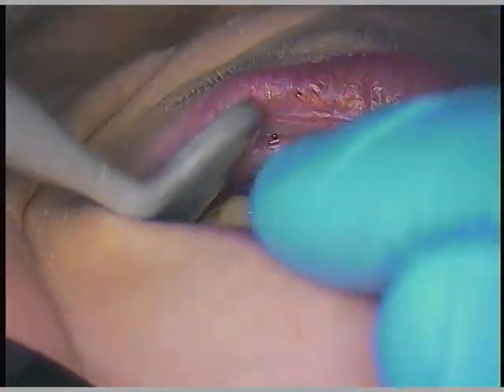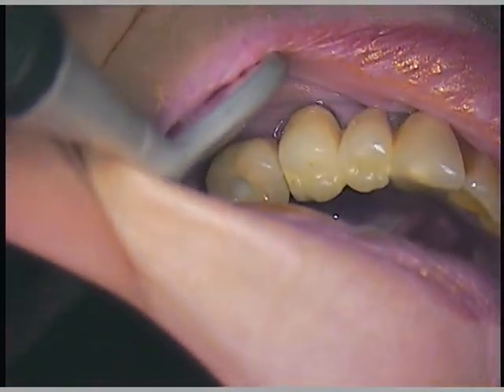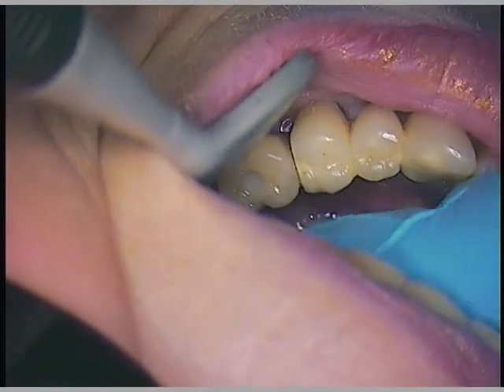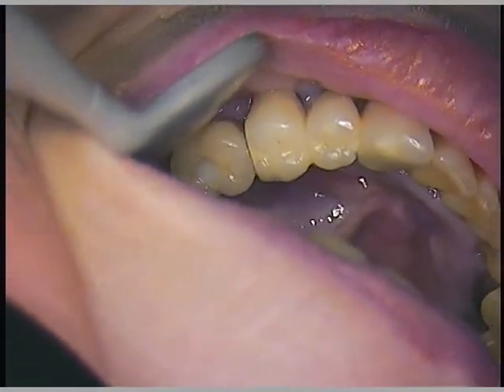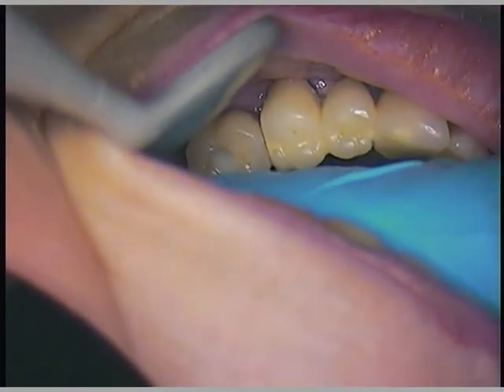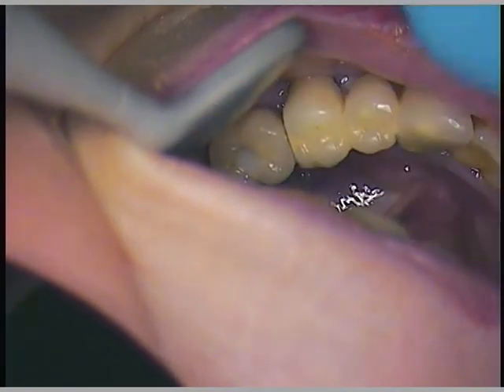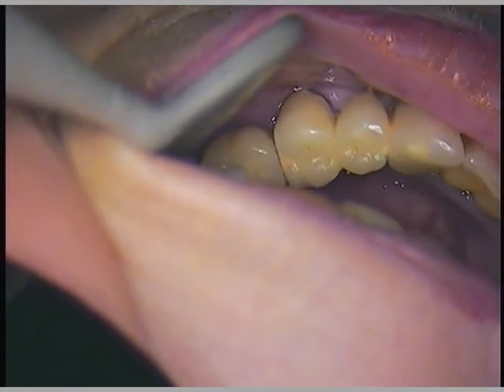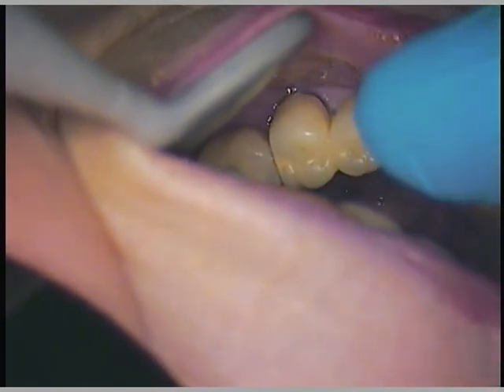It is covered by some composite. And you can see — I'll just demonstrate — it has mobility, so it's not really abutted up against the adjacent bicuspid. We want to help her by removing the screw. It has a stripped head, so we have to go ahead and formulate a method of getting that screw out.